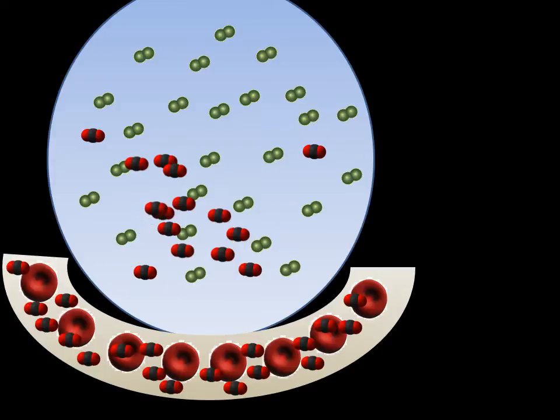So when that patient actually exhales, so if they're breathing really slow and shallow and they finally exhale, that carbon dioxide that we measure is going to be really high, and then we can assume that the carbon dioxide in their blood is also high.